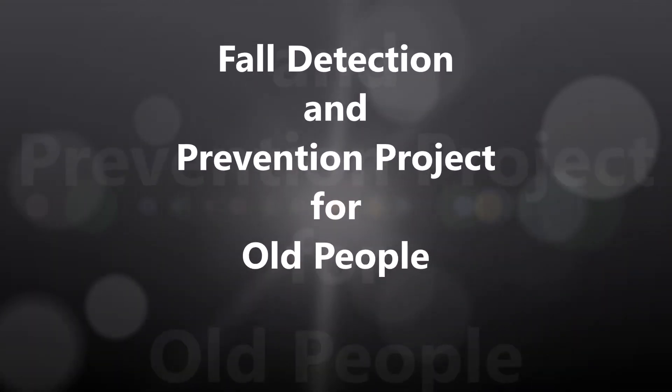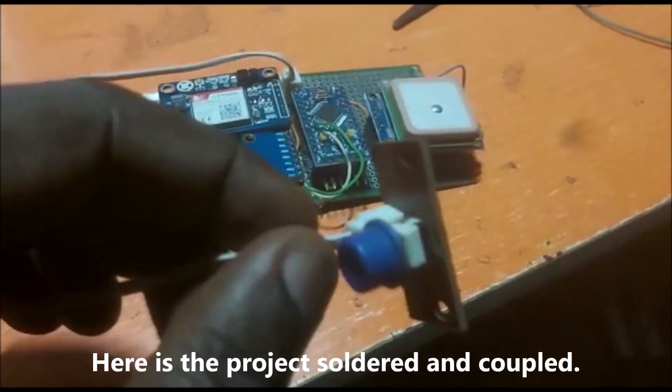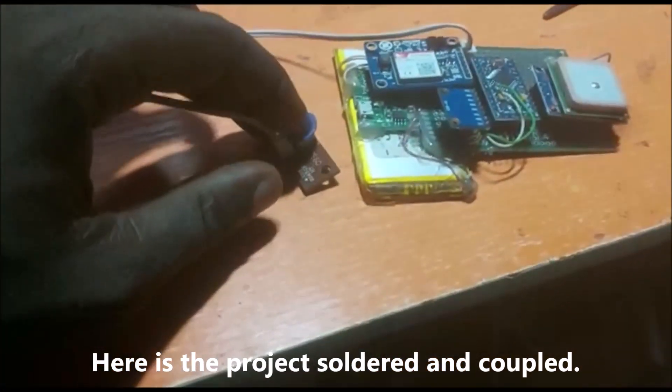Welcome to another video tutorial. Today we will be demonstrating a fall detection and prevention project. This project is very helpful to the elderly, since it helps their guardians and physicians know their whereabouts and know if there is an emergency, like when they have had a fall or not.